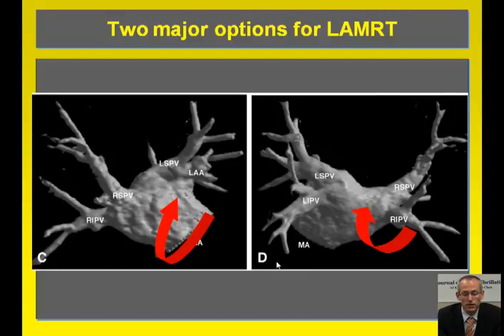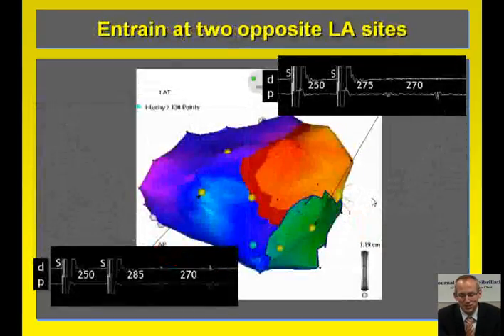When you think of left atrial macro-reentrant tachycardias, there are basically two options after CFAE ablation, and that are those where the macro-reentrant tachycardia circles around the mitral annulus, and those where the critical isthmus is the left atrial roof. So that makes it a little easier that you have only these two options.